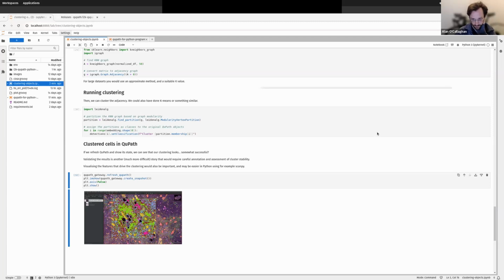Can you do some segmentation and store a GeoJSON file using QuBaLab? Yeah, so the GeoJSON file you could write to disk in JSON format and definitely read it back in either in QuPath or read it back into Python, or any language really that supports GeoJSON or can parse JSON objects.